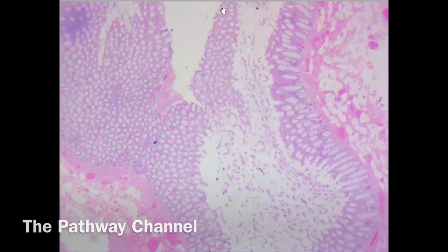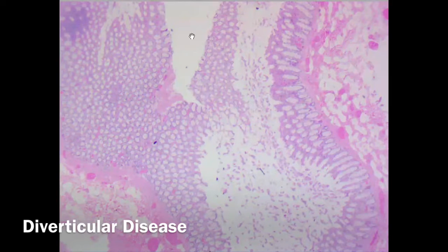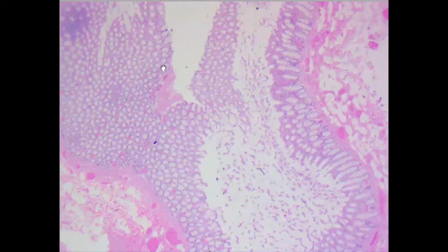Today, I will share with you the slide for diverticular disease. As you can see here, this is an interesting one, and this is the mucosa. And we have 4 layers: the mucosa, the submucosa, the muscularis propria, and the serosa. And in diverticular disease, it's just herniation or outpouching from the gut wall. This is what is meant by diverticular disease.